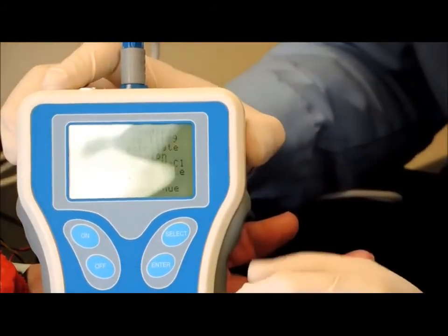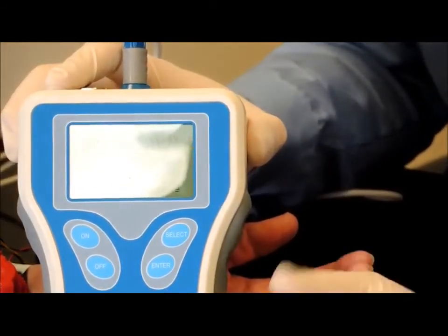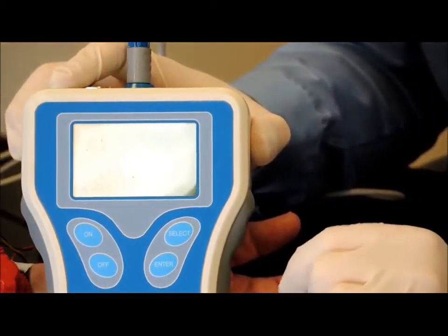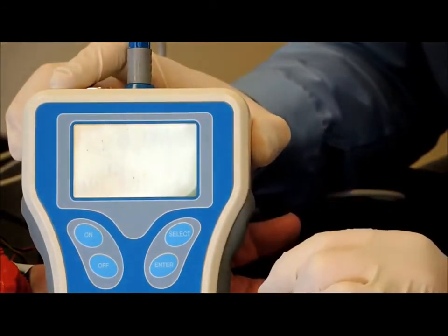That recall reading is important because if you had suppressed the values, that's the only way that you can get that value back, is by doing the recall reading.